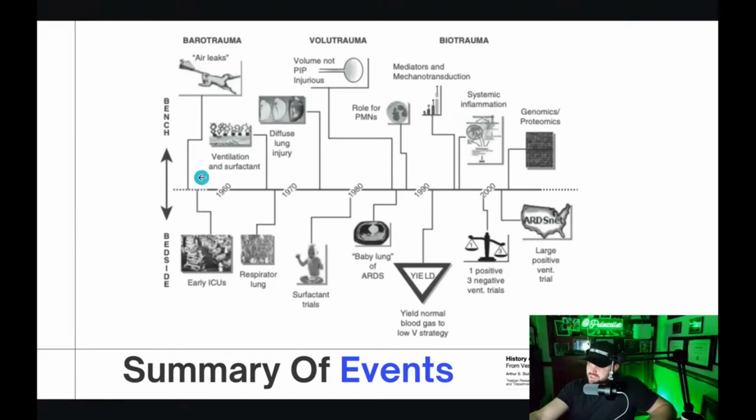So we go through the early 60s. This is from History of Mechanical Ventilation, I think written by Slutsky. Initially I think we didn't really understand the concept of PEEP. We thought that large tidal volumes prevented atelectasis, which is where anesthesia was coming from, using large tidal volumes in the operating room. We really didn't have this thought of PEEP until much later.